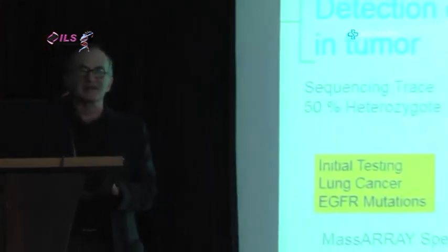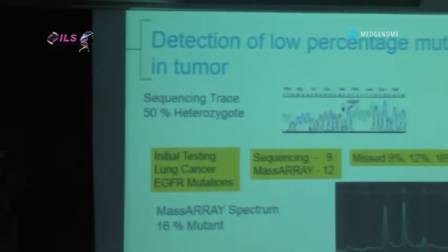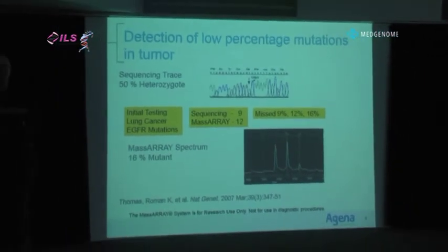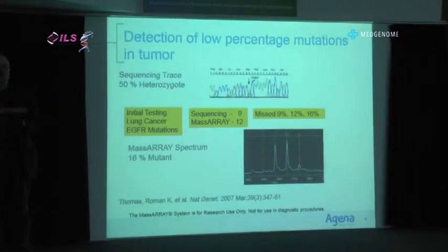You're doing non-invasive prenatal testing on cell-free plasma DNA here, so you're familiar with that process. It's tremendously effective. It's quite expensive. It requires an infrastructure for handling the data and doing the sequencing that's awesome. And in pregnancy, the good news is you only have to do it once per patient.